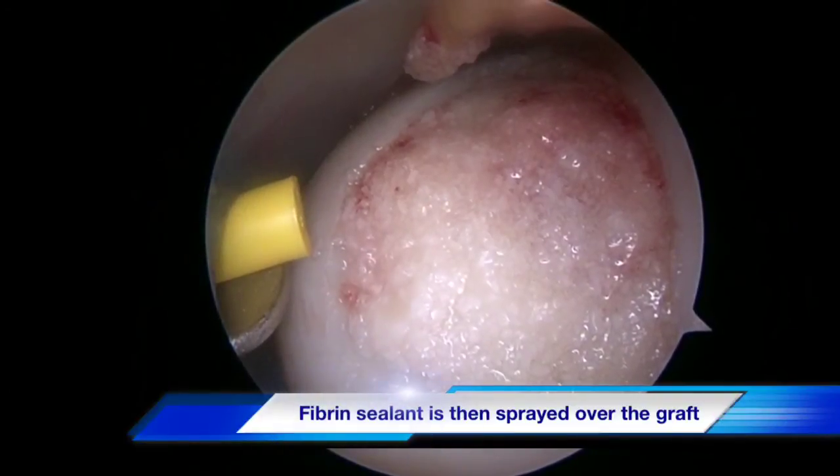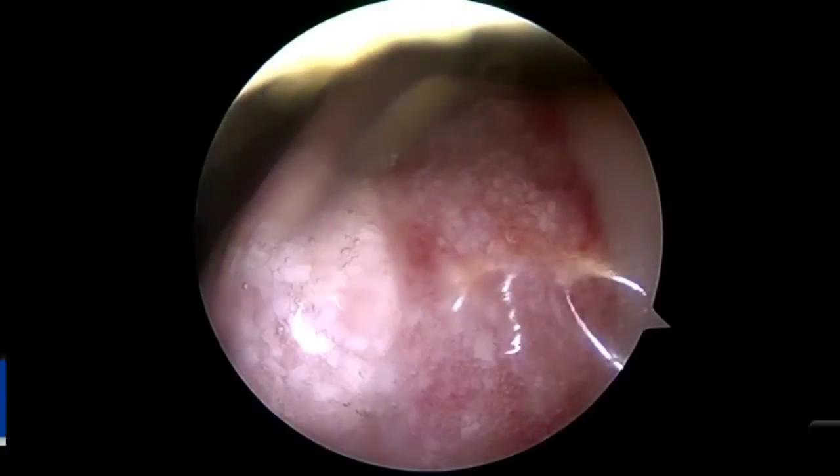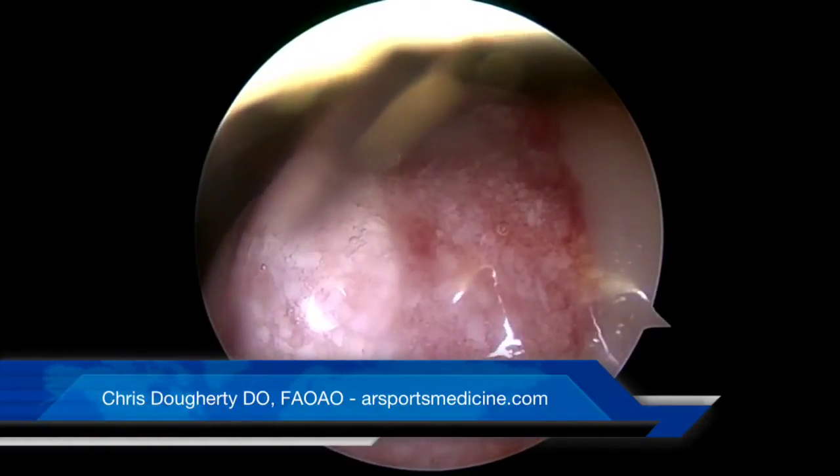Once the biocartilage has been packed into place, it is now sealed via the cannula with a commercially available fibrin sealant.